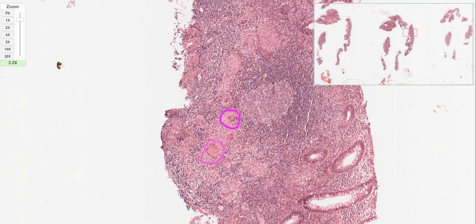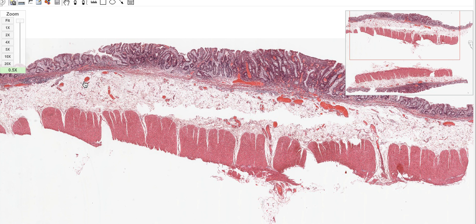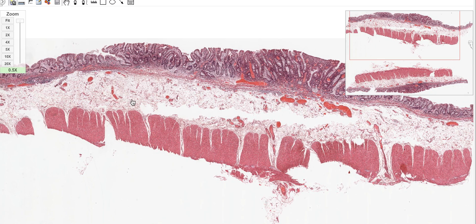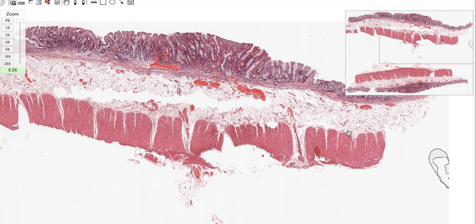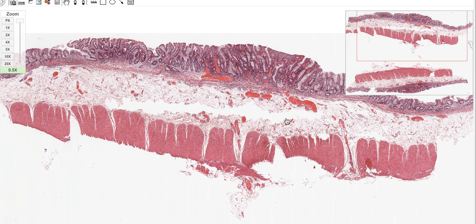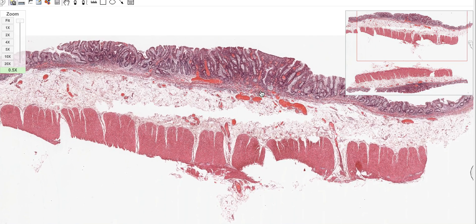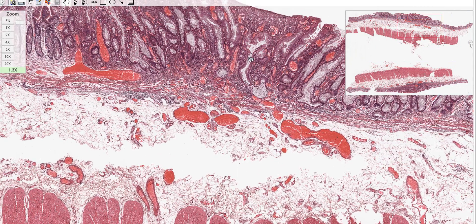Now I'm going to compare this with ulcerative colitis, the most important differential diagnosis. This is an entire biopsy of a colon after resection. First point: this part is clear of inflammation - the muscle layer is absolutely normal, no blue color. So I'm not having transmural inflammation. Scrolling through the entire biopsy, I'm not seeing any pale center with a rounded structure - no granulomas. I'm trying to rule out Crohn's disease.